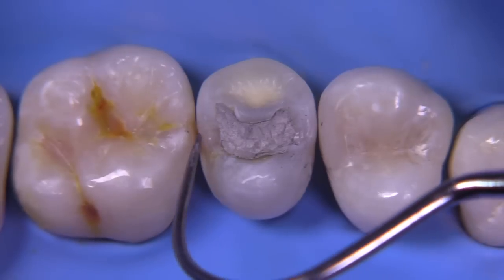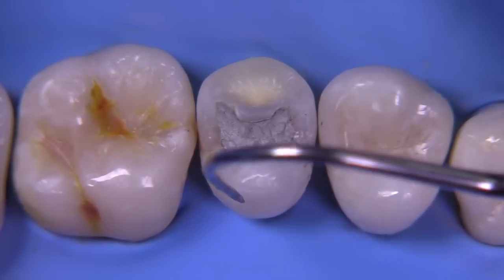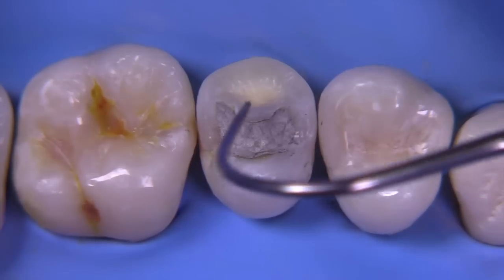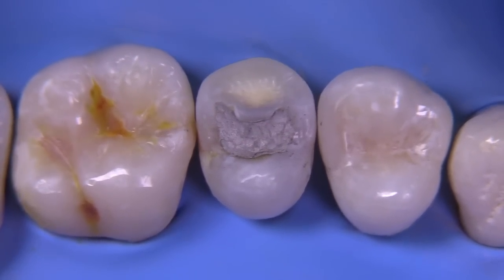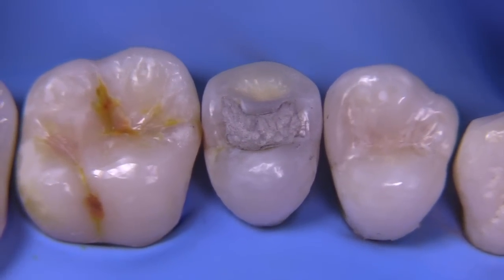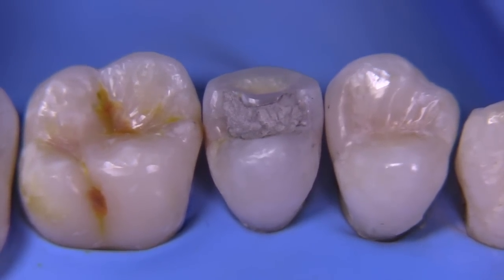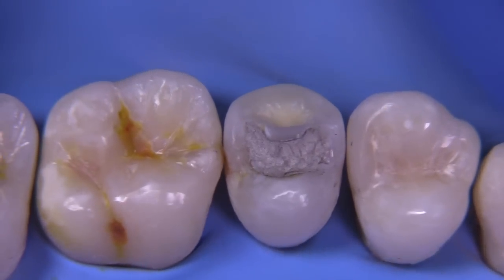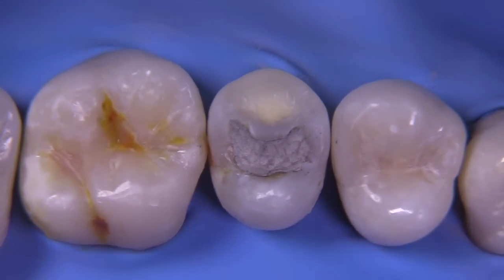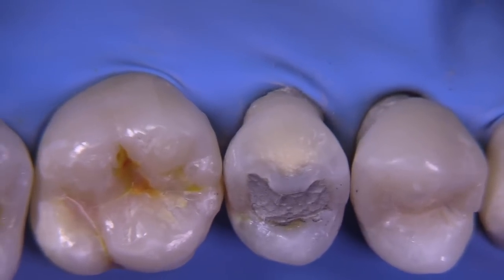This tooth has a fractured facial, mesial and distal caries, and an unknown amount of caries undermining that lingual cusp. We'll have to remove that amalgam and assess the situation. It's nice to consider a direct restoration that can be done with composite resin bonded to the enamel, and I think this can provide the patient with a nice option that sometimes we consider unachievable.